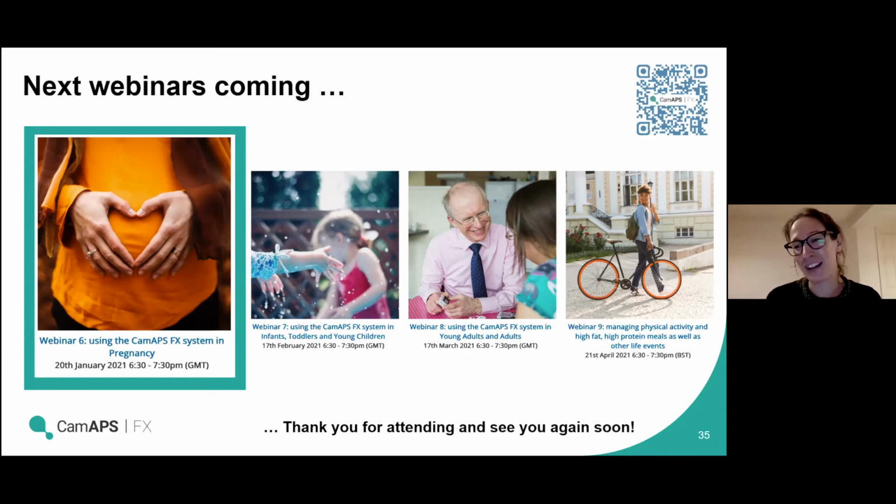I think it's really tricky, and the decision making of type 1 diabetes is hard enough, let alone bringing in additional things. I know they're there to help. Personally, I think the trend arrow of the CGM is the biggest decider. What do you think, Sarah?